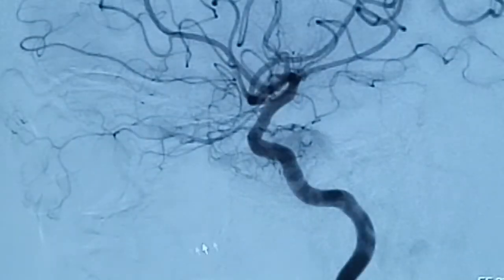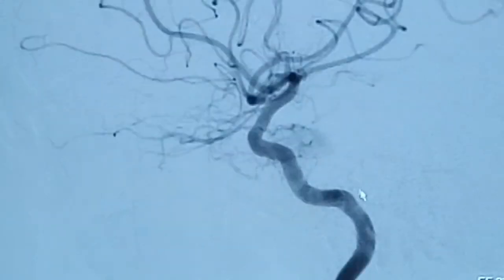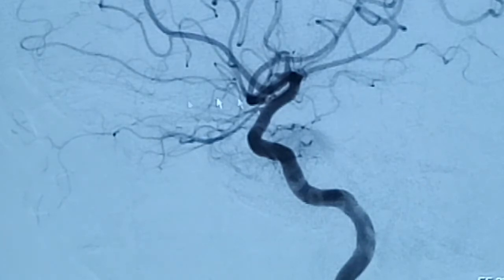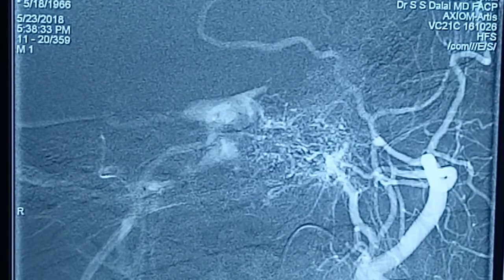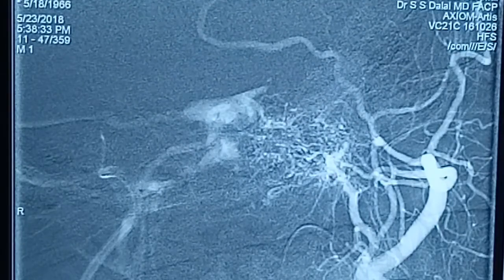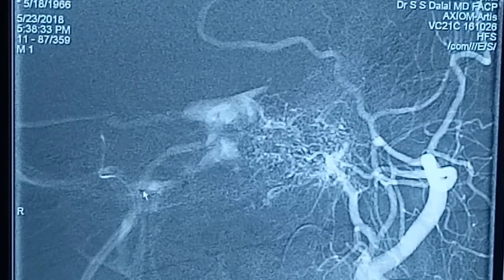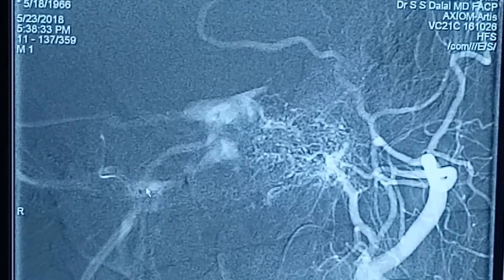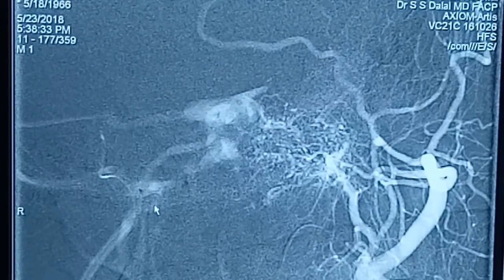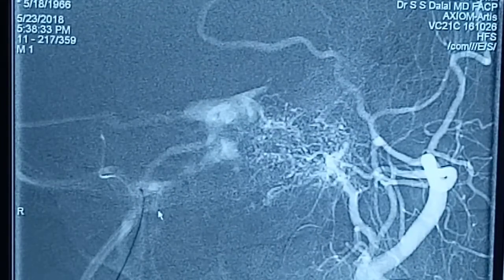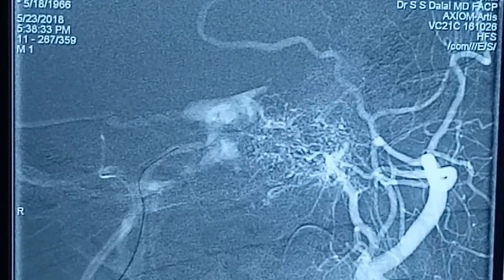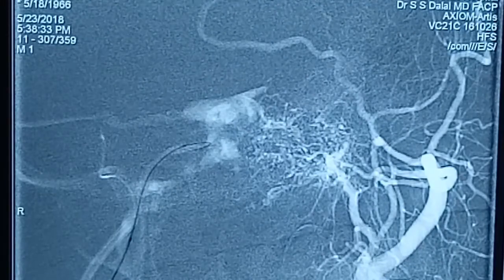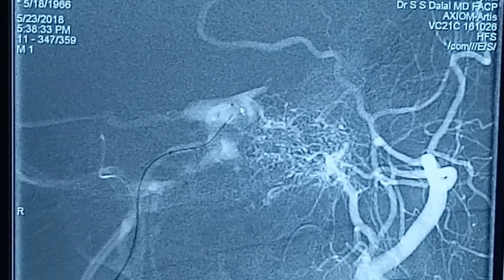On the right ICA angiogram, there is an early blush of the cavernous sinus, but it does not look significant. I have placed a guiding catheter and am now advancing the microcatheter, navigating carefully. There is some challenge in this navigation because getting into the right veins is not always straightforward, but I am able to progress and move all the way into the cavernous sinus.